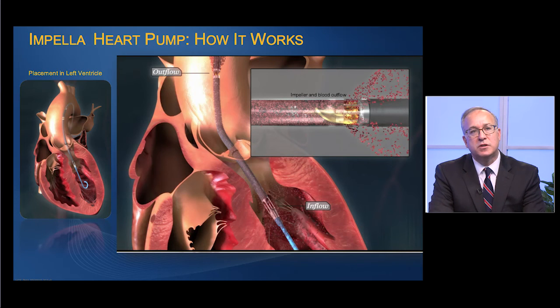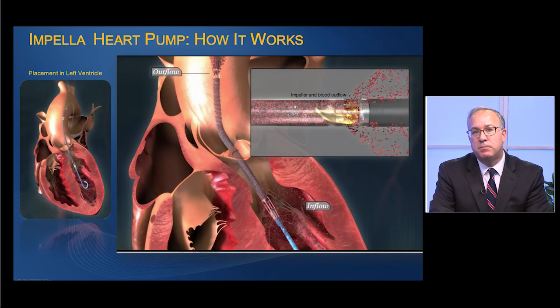Impella is the world's smallest heart pump. It is placed most commonly via the common femoral artery in a retrograde manner across the aortic valve and has a variety of features that would be desired or considered ideal in a mechanical circulatory support system used for the treatment of cardiogenic shock. Impella's ability to be rapidly deployed by cath lab and surgical teams early in the management of cardiogenic shock results in multiple useful goals for patient stabilization and myocardial recovery.